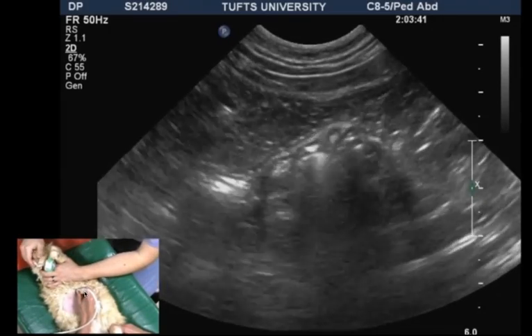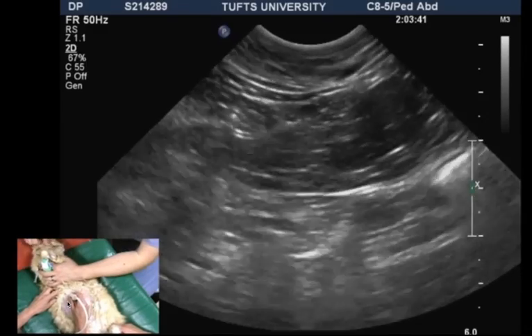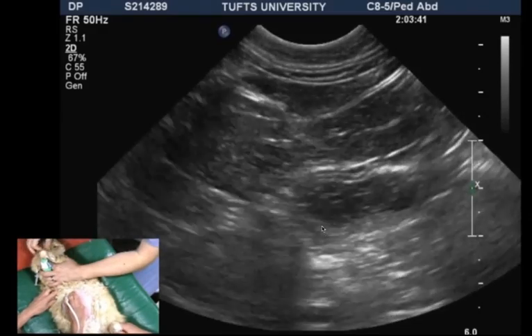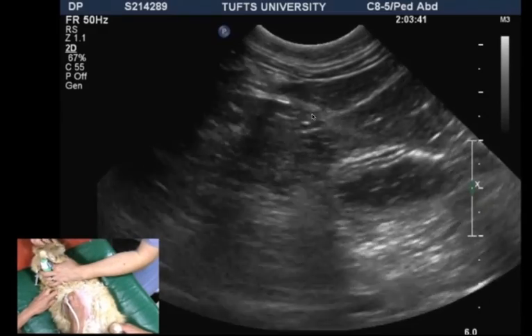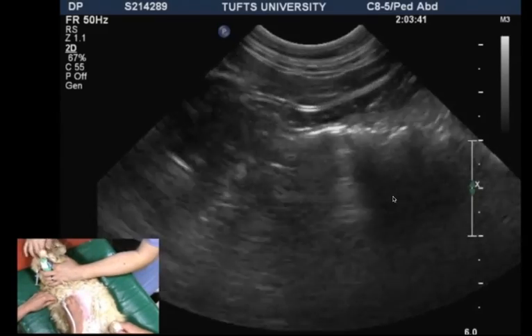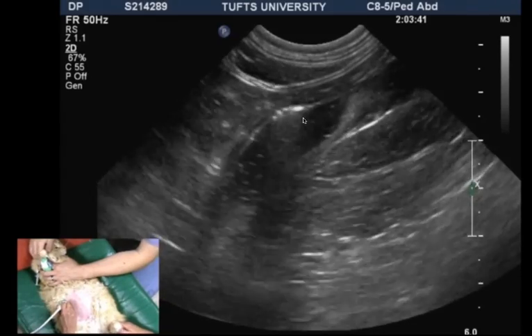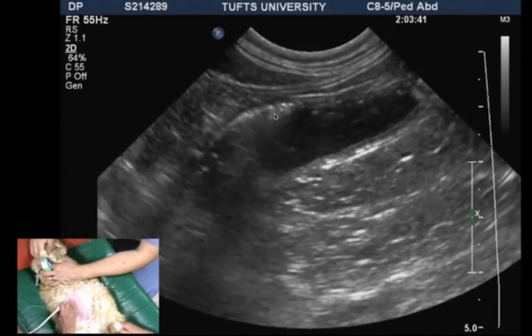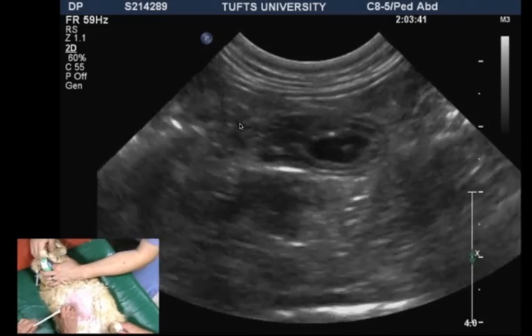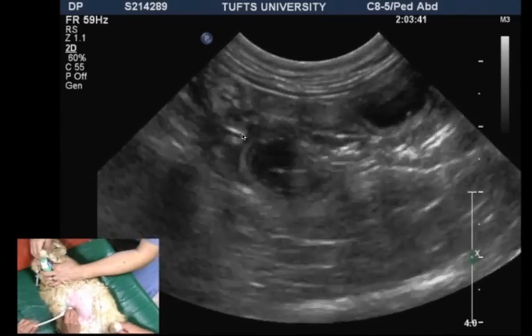We then migrate the probe slightly towards the right side of the cat and reach the fluid-filled pylorus, located dorsally to a very large amount of falciform fat. We then reach the fluid-filled duodenum, where a small amount of gas is seen as well. The descending duodenum diameter is about 12 mm, which is excessive. In addition, we see an increase in peristaltic activity.